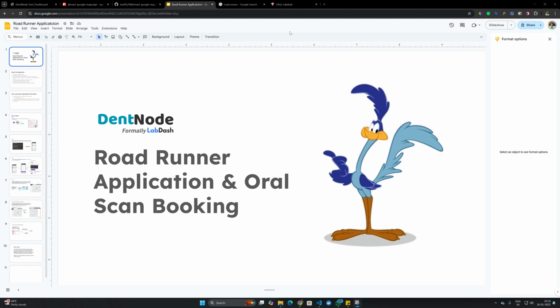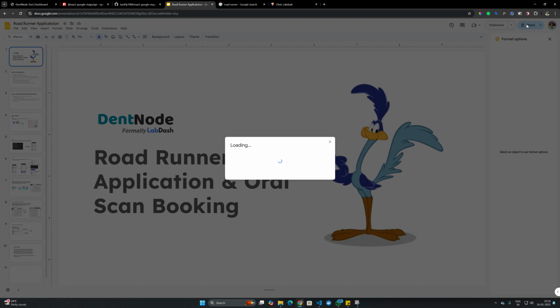I have something really exciting to show you that we have been working on for some time. It's called the Roadrunner application. In this video, I'll be talking about what Roadrunner is and what our future plans are. So, let's get started. Let me tell you what Roadrunner is.